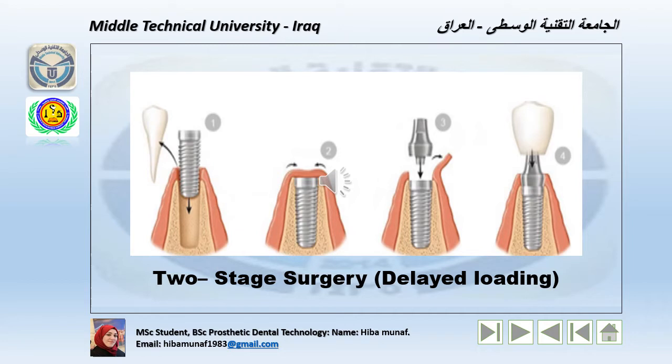Number four, local hygiene issues or anaerobic bacterial infiltration are not critical factors during initial healing because it's covered by the oral tissue. Number five, the crestal and facial region may be directly evaluated at the second stage uncovering surgery and minor defects corrected before beginning the prosthetic reconstruction.